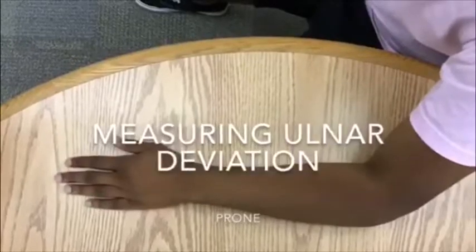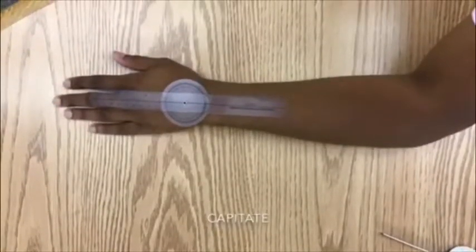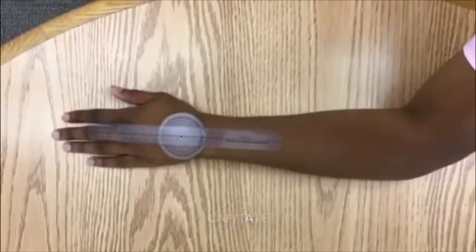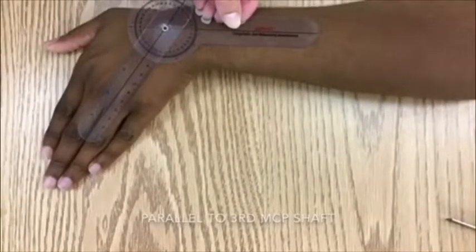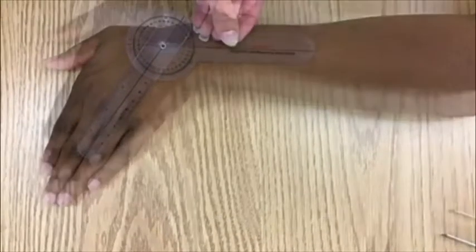To measure ulnar deviation, have the patient sit with their arm pronated on a table in neutral position. Center the axis of the goniometer over the capitate with the stationary arm along the midline of the forearm. Have the patient ulnar deviate. Adjust the movable arm parallel to the longitudinal axis of the third metacarpophalangeal shaft.